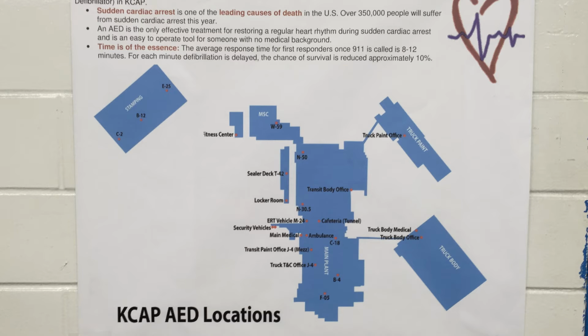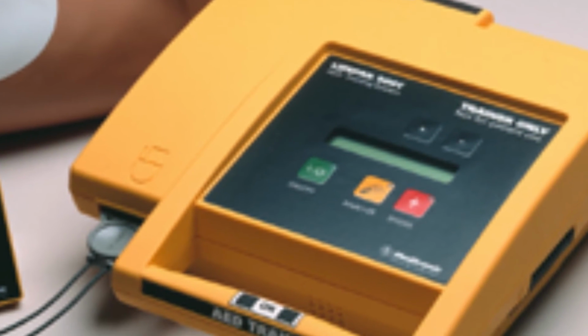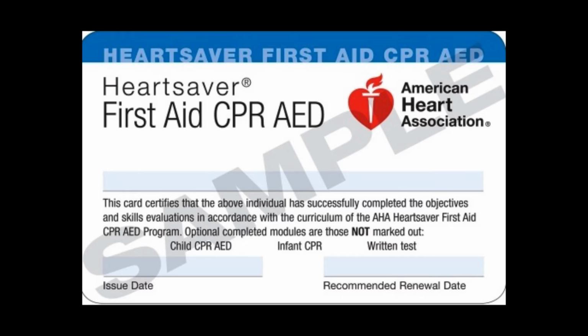And how do you know where those are located? We've got a map distributed around the plant that shows people where they are, and when we do training, we urge people to find the one in their area on the map and then go locate it in person when they get back on the job. This isn't the first time you've had to use an AED here in the plant, is it? Just a couple of months ago, we had another worker who had a sudden cardiac arrest. We did revive him, and he was transported in the ambulance. Unfortunately, he only lived a couple of days after he was revived.